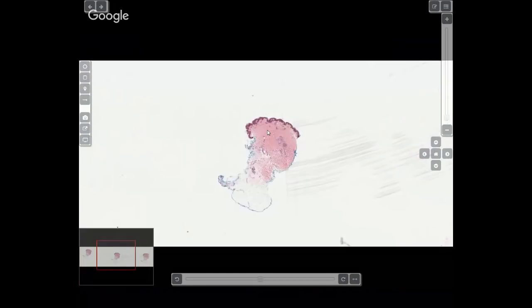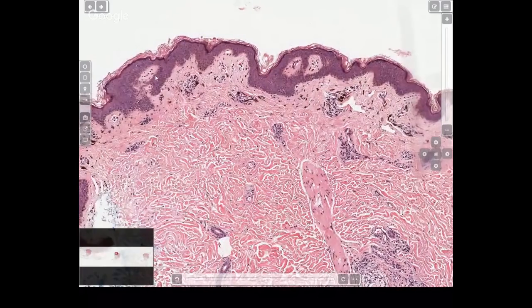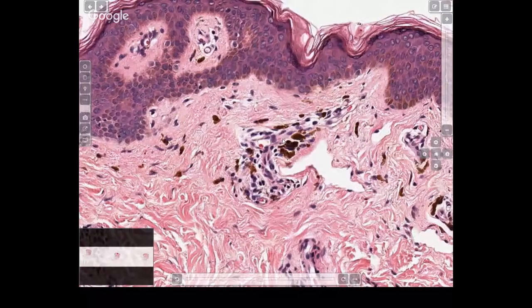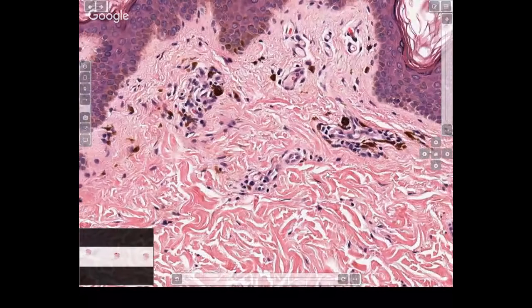Histologically, as the name suggests, if it is a burnt out lichen planus, all the features of lichen planus are gone. So all you see is a very mild lichenoid infiltrate, but very characteristically a lot of pigment incontinence in the dermis. Ashy dermatosis is a very common condition that you're going to see in your practice. We see one every week, so it is going to be one of the common things that you're going to see. Histologically, you might see a mild lichenoid infiltrate, some vacuolar degeneration at the dermal epidermal junction, but the main characteristic feature is this pigment incontinence at the dermal epidermal junction.